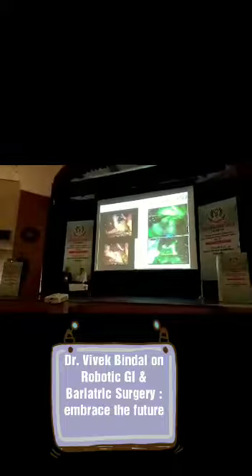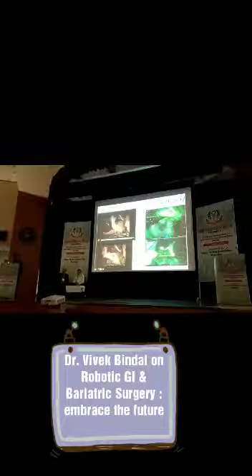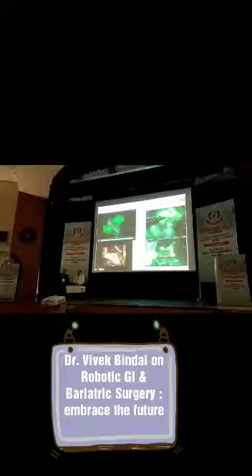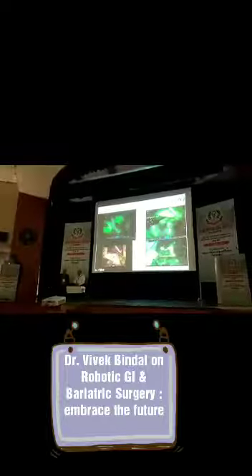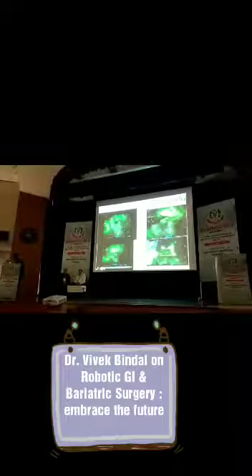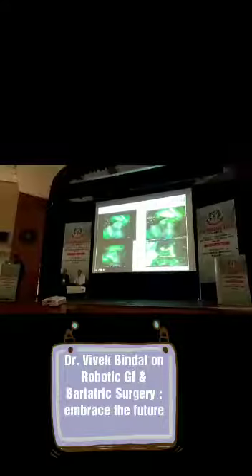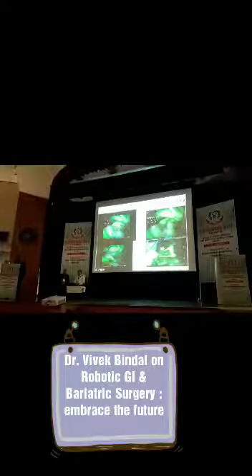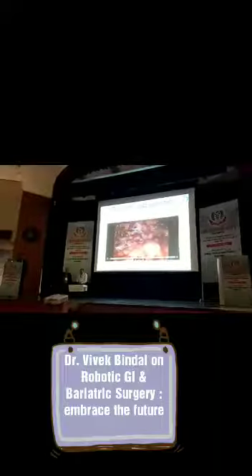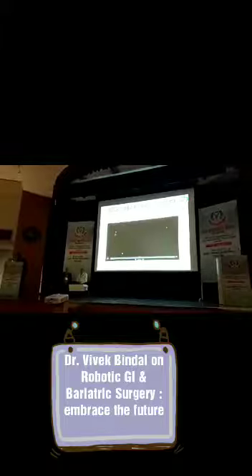So here is ICG cholangiography. It is not just bariatric, but as simple as cholecystectomy. It can save a lot of CBD injuries. You see here, this is the gallbladder, and it lights up the CBD as soon as we switch on ICG. This is the CBD which we have to save, and here in this video you can see that after dissection, also before clipping, you see this is CBD. And here the robotic system is showing us that you have basically divided the right hepatic duct rather than the cystic duct. So these are, I think, some things.